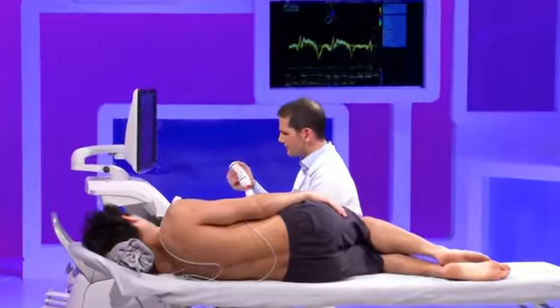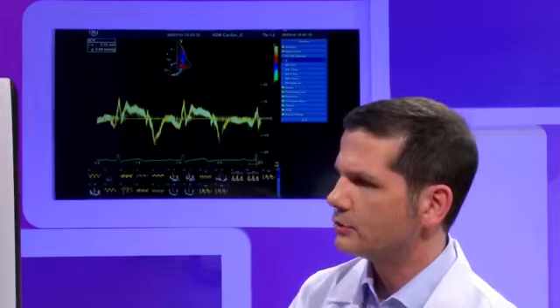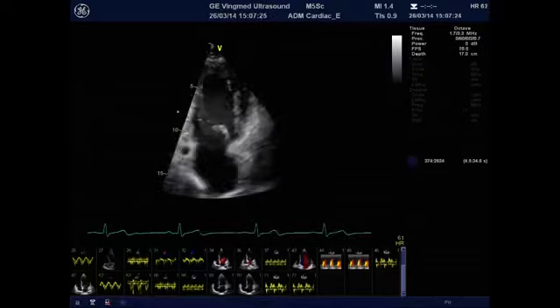Usually in a normal subject, in subjects who do not have wall motion abnormalities, it is enough to record the septum and the lateral wall. In other instances, it is useful to do it also in the other two sides of the annulus, possibly the anterior and the inferior one, as we can record by using an apical two-chamber view.